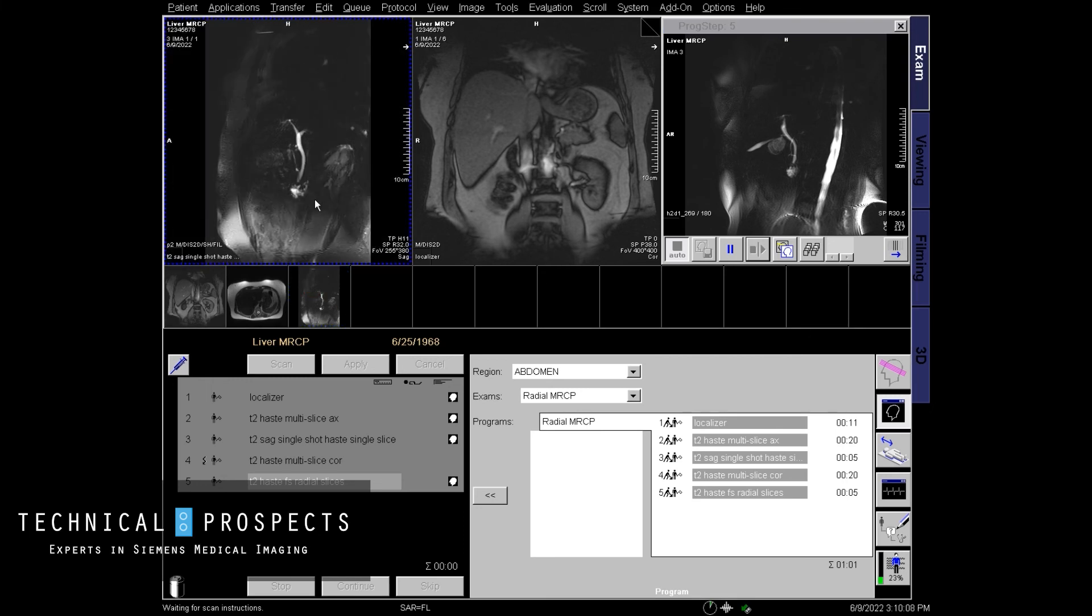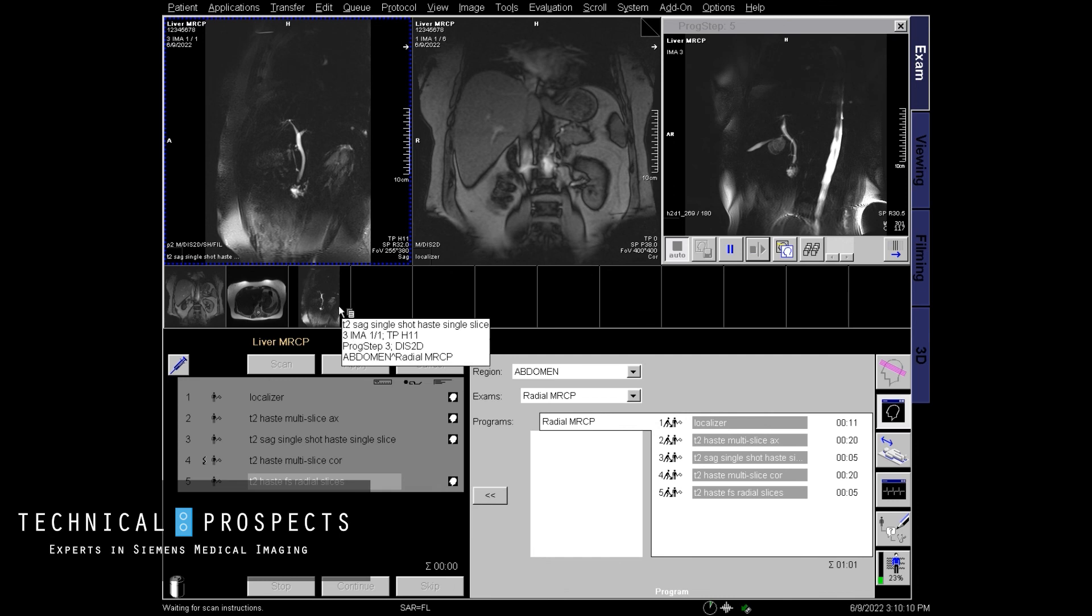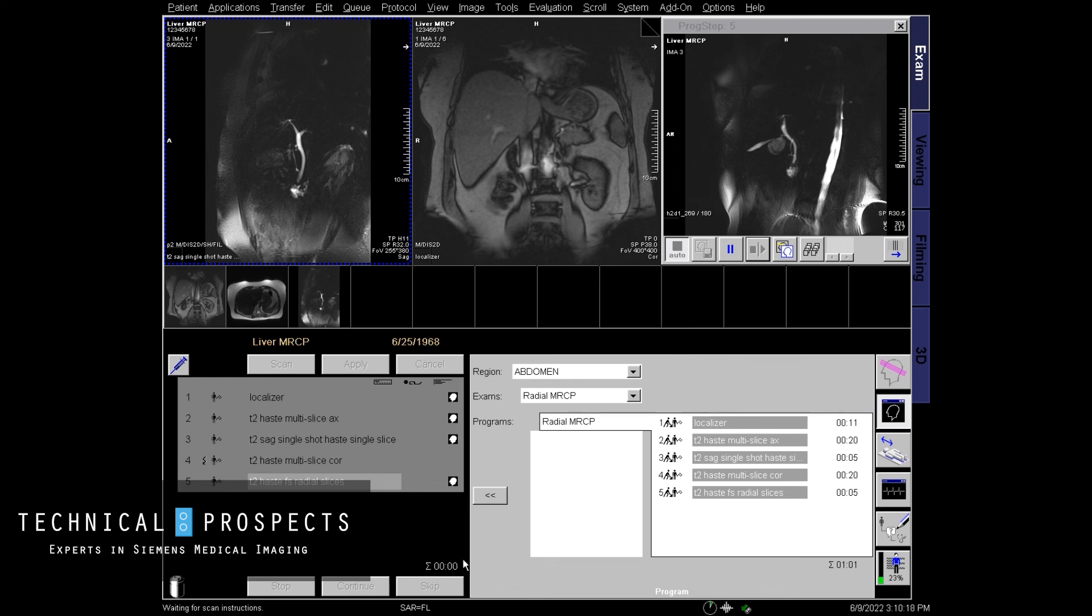And here are our radial slices going around in a complete 360 degrees, five slices.